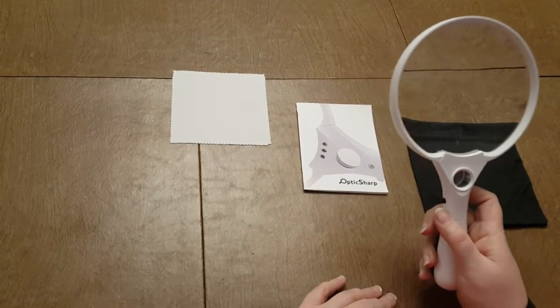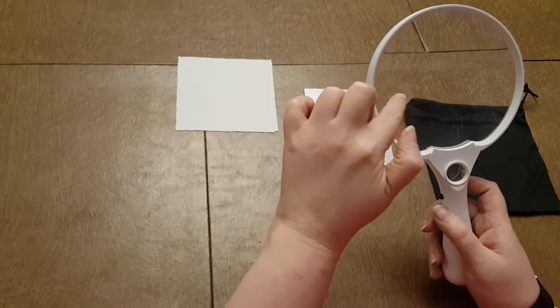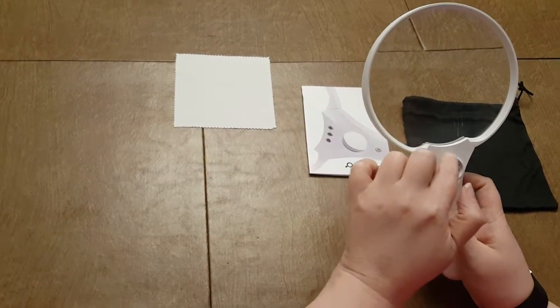It has three different magnification levels. This big circle is two times, this little circle in here is four times, and this circle here is ten times.